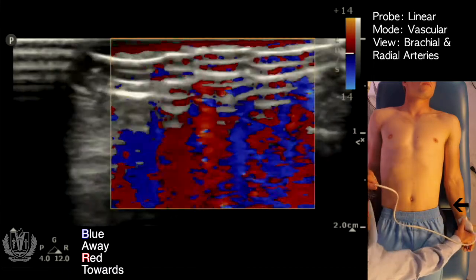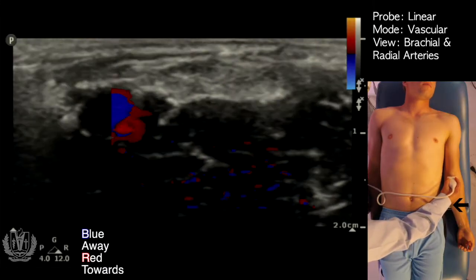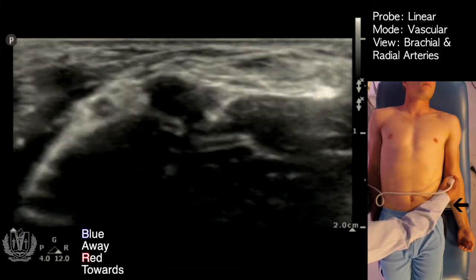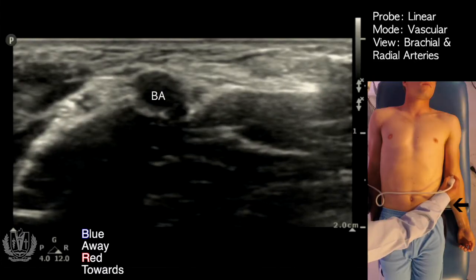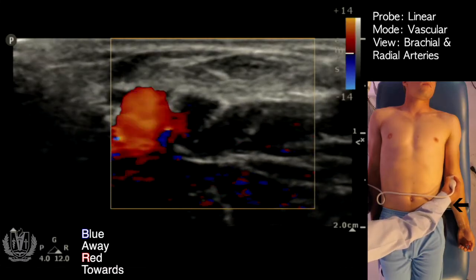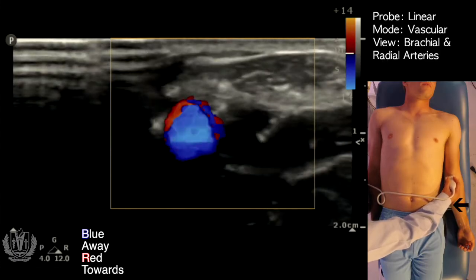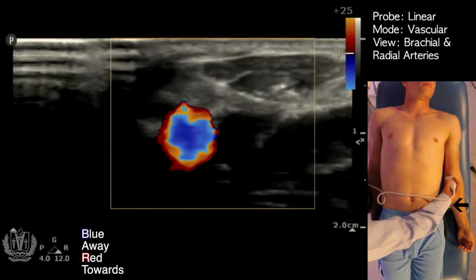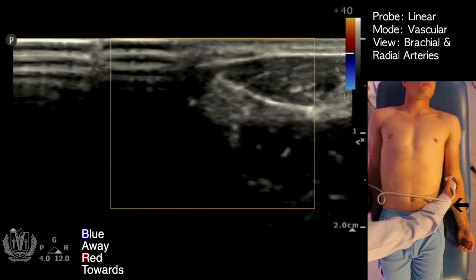Another artery you can look for is the brachial artery — the same artery you use when measuring blood pressure. Here in the antecubital fossa is your brachial artery. You can see it pulsating, and once again you can get color flow on it. You can see the flow of the vessel. This one has a higher velocity — you can see it's more than the radial artery.